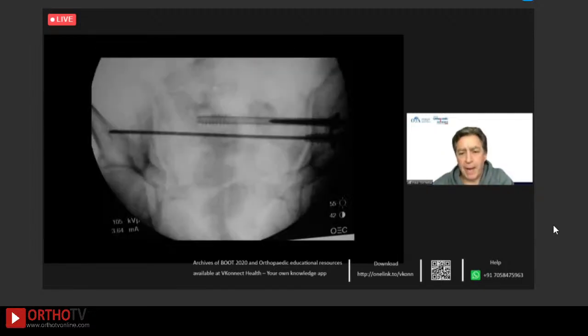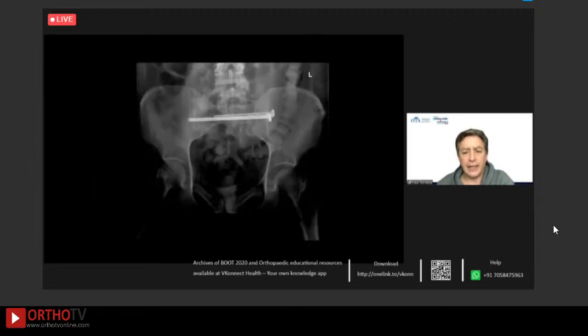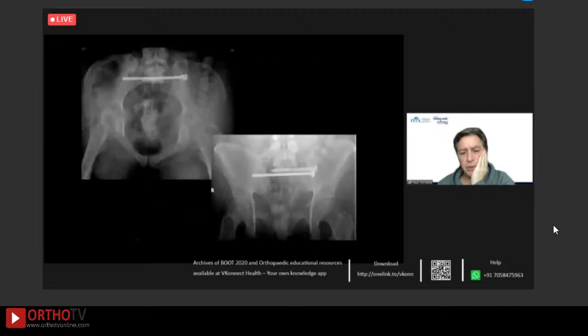When we pulled it back down, we were able to get those tracts again. These are the original screws that were in initially on the bottom one, and the top one is a new screw. You can see we went all the way across through that same tract. Again, I used partially threaded screws and lagged the crap out of it, so I compressed it and it got a really, really good bite. Then I didn't fix the front because I wasn't too worried about the rotational instability. This is what we ended with.